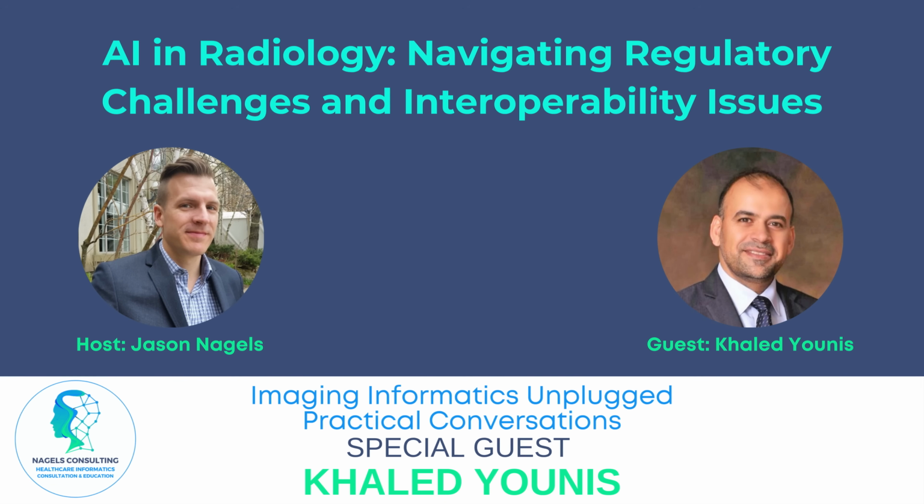You have the PACS, you have the RIS, the EHR, and until now, there are some problems in getting the information, the images at the right time. Now we go to the cloud, and that also introduces new challenges. So even though we try at the IHE to work on profiles that make it easy for vendors to apply the standards, DICOM, FHIR, HL7, in a way that improves the workflow, interoperability is still a major hurdle.